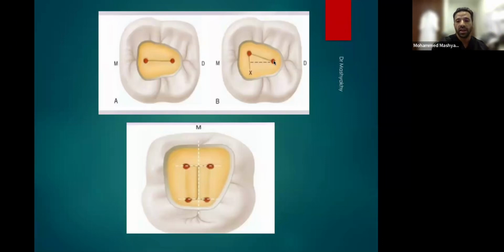But in another case, with the distal canal, you draw an imaginary line to the mesial side and you find the other mesiobuccal canal away from the center. That means definitely there is another canal on the other side. So put this picture of these three teeth in your mind. Always, you're going to catch a canal this way, especially in the molar. Sometimes about 40% of the distal roots have two canals. So whenever you find any canals and you draw an imaginary line between them and you see a deviation in the mesial, buccal or lingual side, you know there are two canals in that root, okay? Put this picture in your mind.